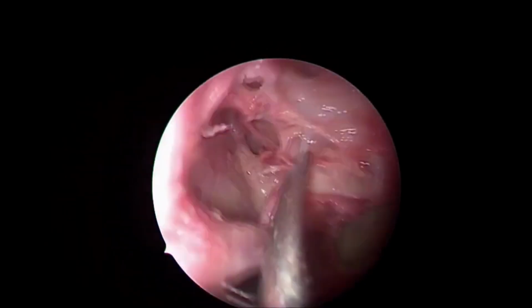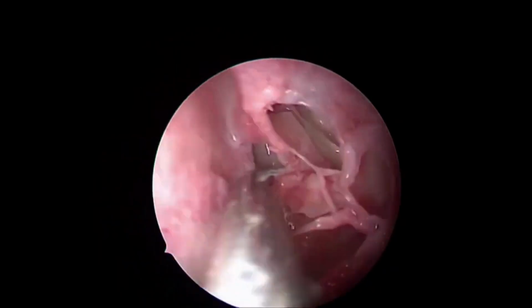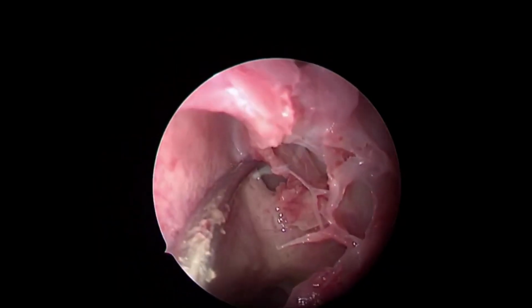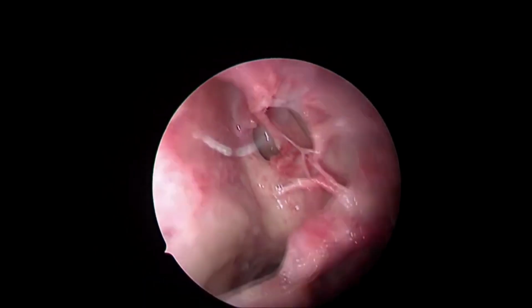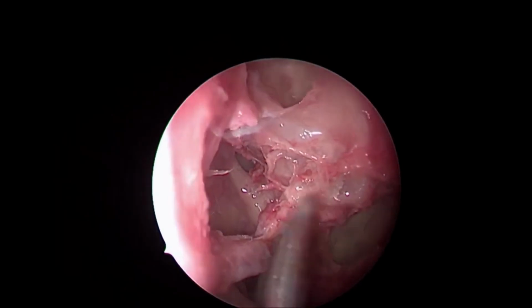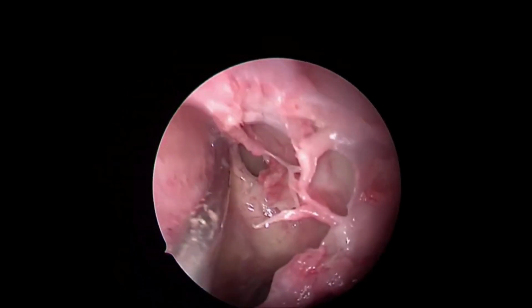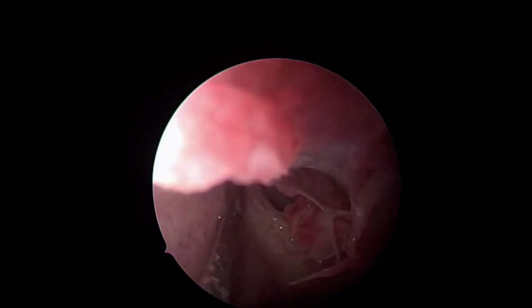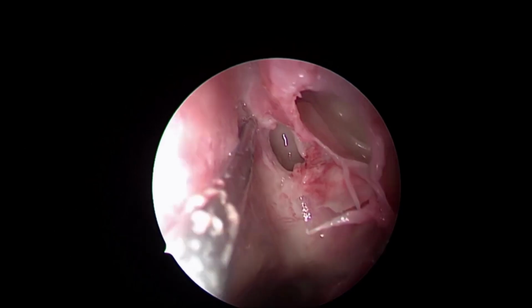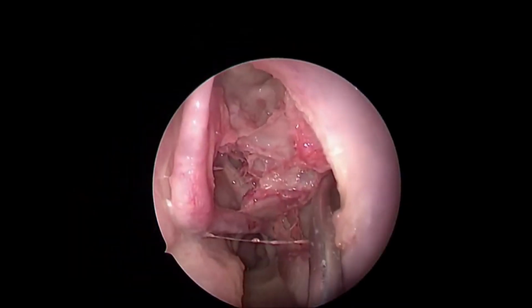Why not to go above this line? Because this ostium is never at the level of the floor of the sphenoid sinus. This is high up. This is close to the roof many a time. So if I don't take into consideration this line, and if I am not able to see the sphenoid ostium and look for it somewhere above, I may breach the skull base. And that is a disaster. So, this is such a great landmark, this life-saving line.